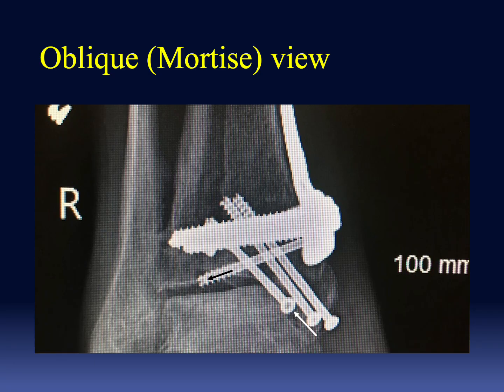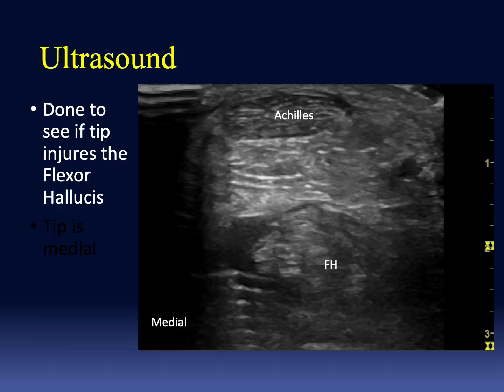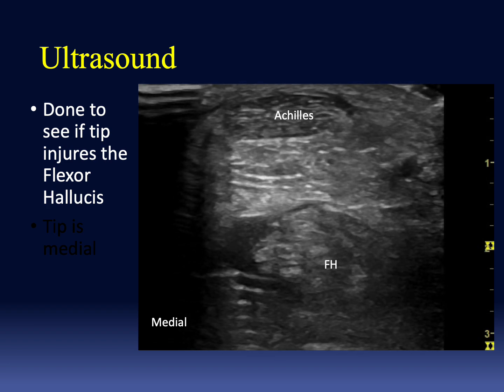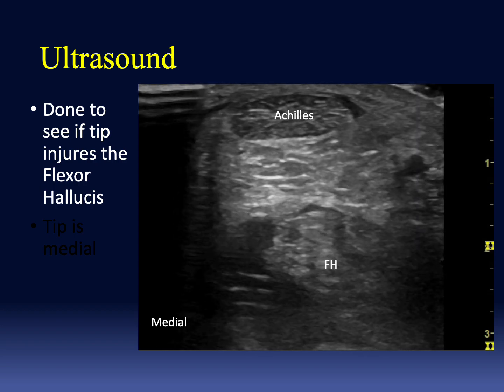In this mortise view, it looks like the screw indicated by the white arrow has a tip that is somewhat more lateral, but we have to remember that the mortise view consists of an internal rotation of the tibia, so anything in the back of the tibia will look as if it were more lateral than it really is. In this transverse view, we can see that the screw, the repeated pattern to the left or medial side of the flexor hallucis, is not, in fact, on the flexor hallucis.